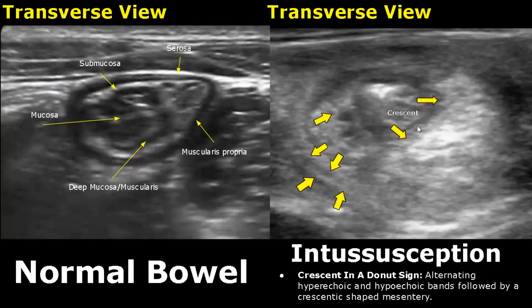A crescent-in-a-donut sign can be seen in the transverse plane. There are alternating hyperechoic and hypoechoic bands seen on one side and a crescentic-shaped hyperechoic structure made of mesenteric fat on the other side.